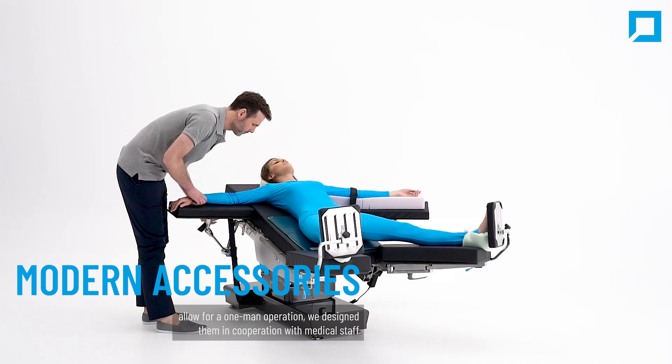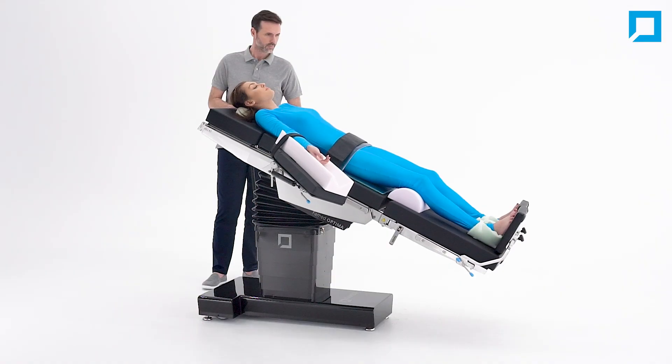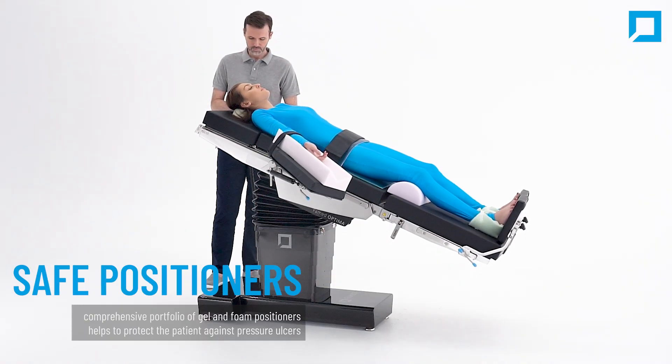We design accessories in cooperation with medical staff, offering a variety of use-safe positioners.